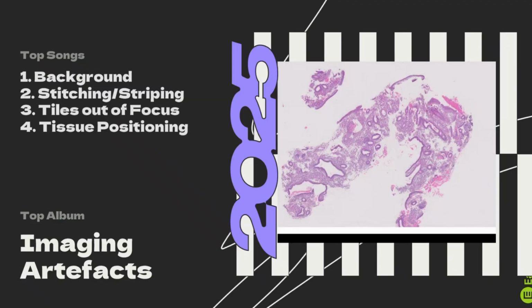Tissue positioning. So again, this is coming back to why our participants fail. You can see yourself, there's tissue that's gone outside of the scanning area, and it is just an immediate fail for us.